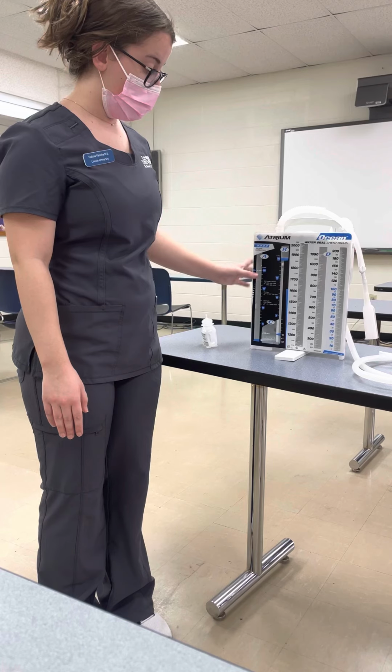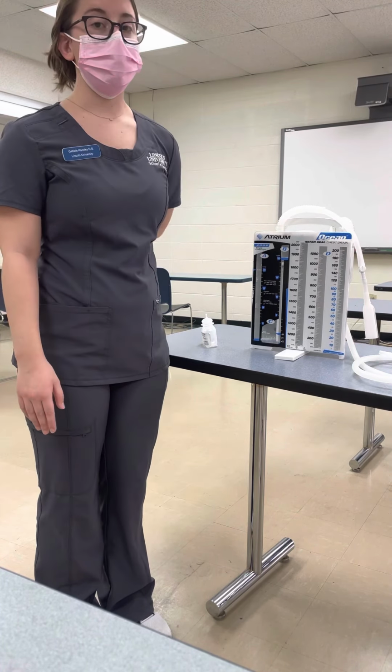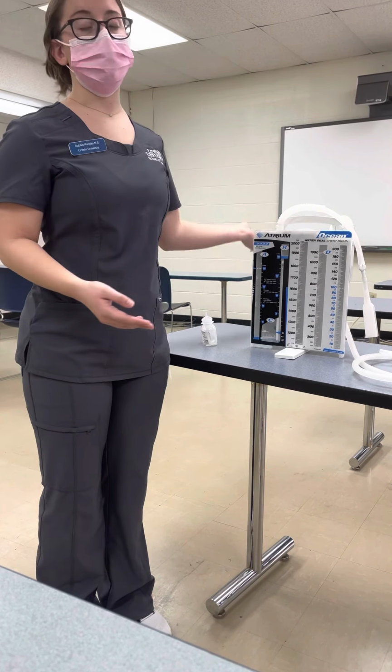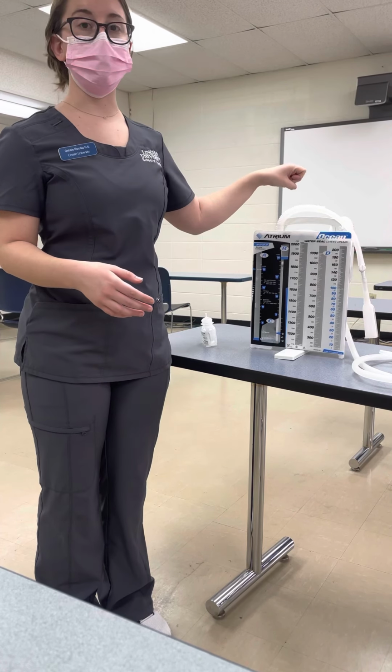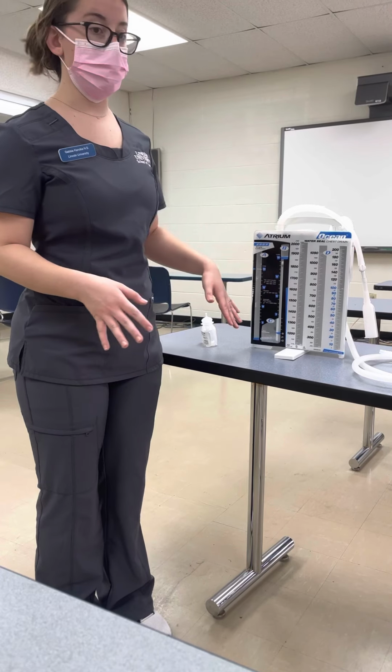Now, the suction chamber here only works when the wall suction is turned on. So again, we would want to make sure that the provider has that noted as an order, and if we need to turn it on, we can turn it on through the wall suction. If it needs to be turned off, we just turn it off through the wall suction. We never empty or drain any of these chambers for any reason.